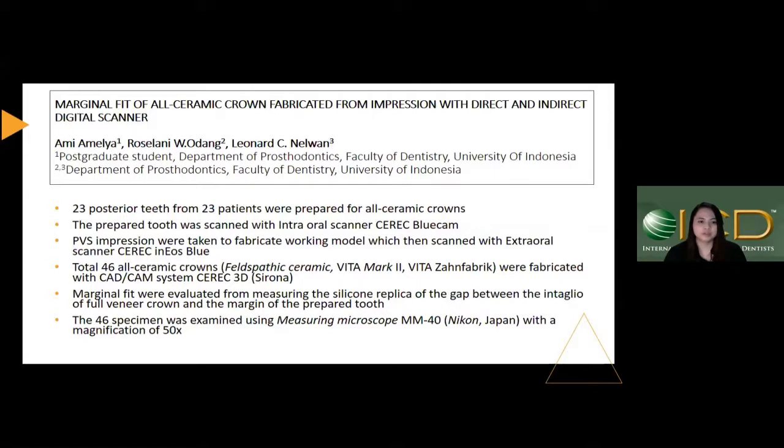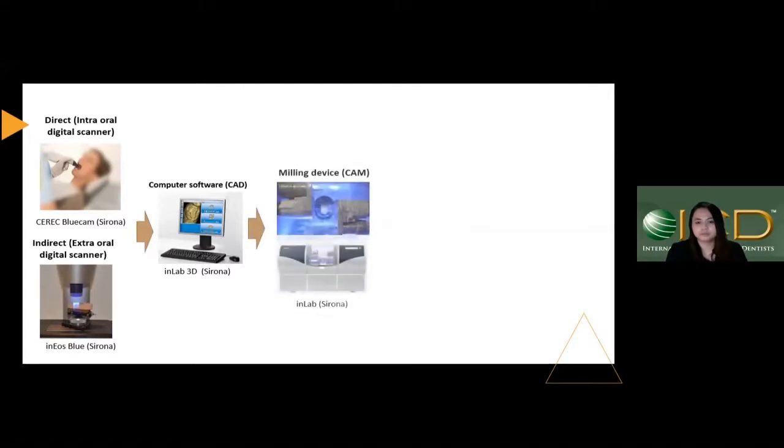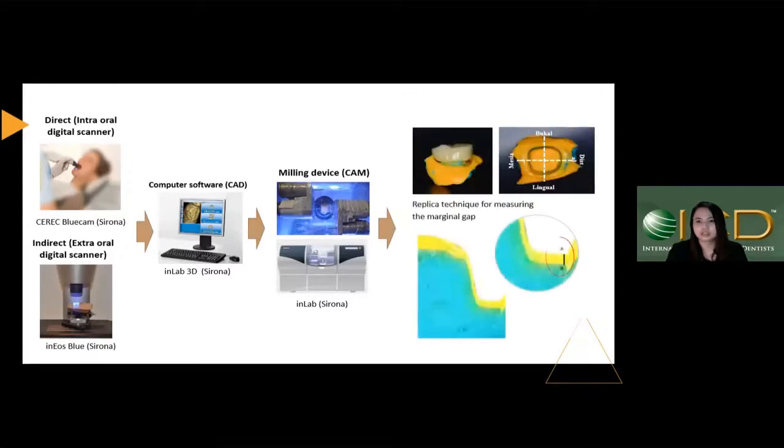And I fabricated the all-ceramic crowns with the CAD/CAM system, and then the marginal fit was evaluated using a silicone replica and put under the microscope. So first of all, I scanned the patients with the intraoral scanner and the extraoral digital scanner. And I designed in the computer software and milled the all-ceramic restorations. And I used the replica technique for measuring the marginal gap.